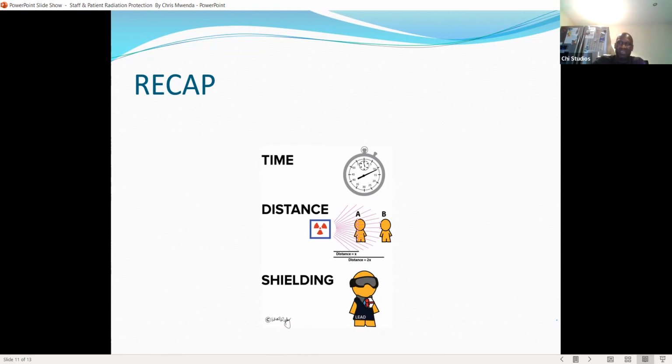Say, look, you have taken the picture. You don't need to go on. That's more dose you have. You're impacting on the patient at the end of the day. And obviously, we're also impacting on the member of staff because we are being exposed to scattered radiation.